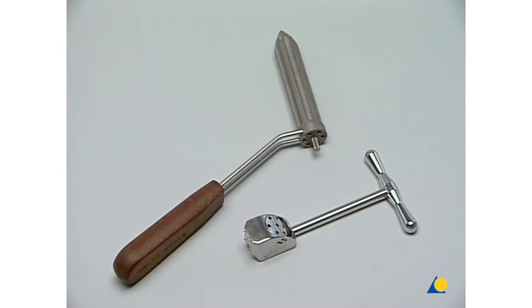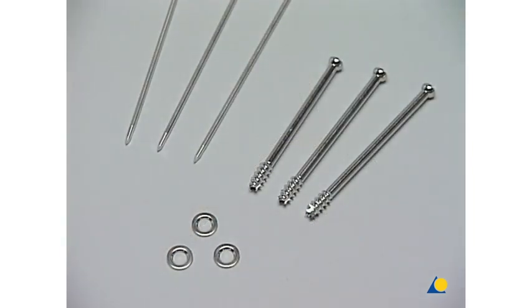We need these implants: three 2.8 millimeter guide wires which have a threaded tip. For every procedure, new wires should be used. Three cannulated screws and two or three washers.